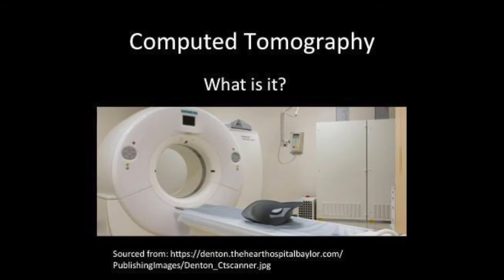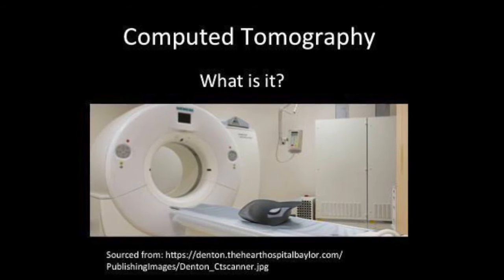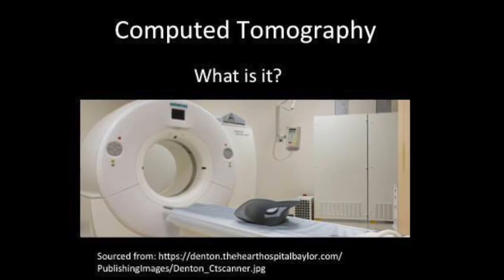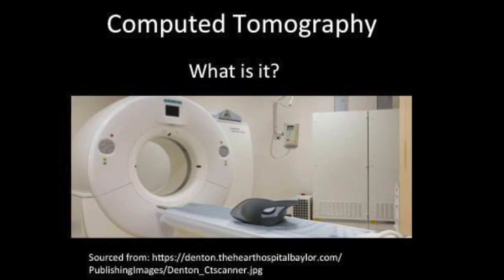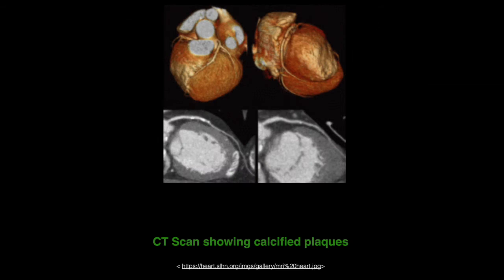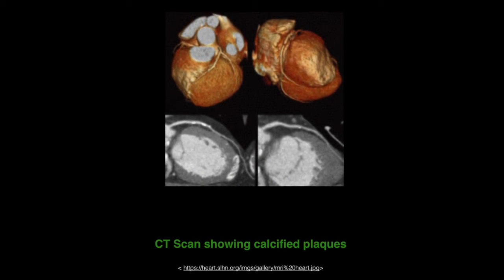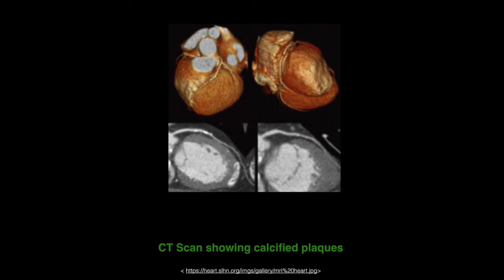The first imaging modality that we will be exploring is the computed tomography scan. Tomographic imaging is usually a slice through the viewed area, in this case the cardiac region, and by using X-rays has full 3D localization and improved soft tissue contrast, which is ideal for imaging of the cardiac region. This is a form of anatomical imaging rather than functional, viewing the structures within the heart.